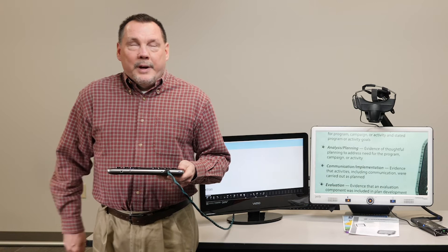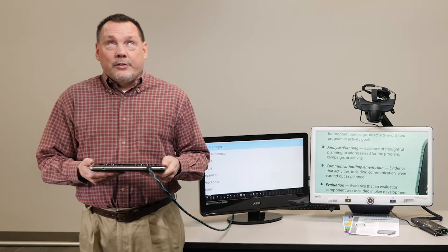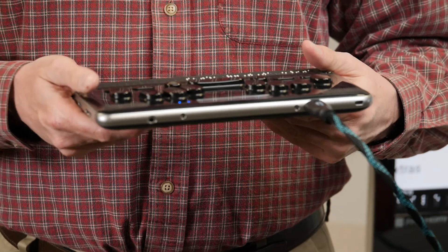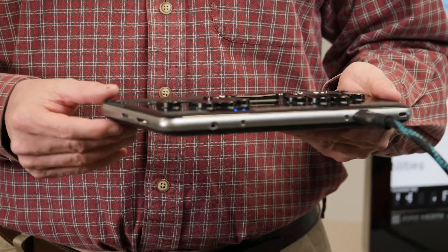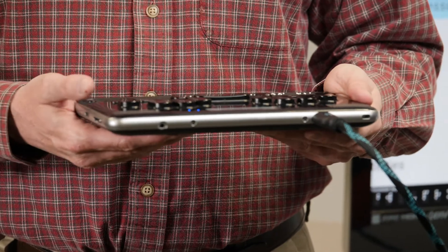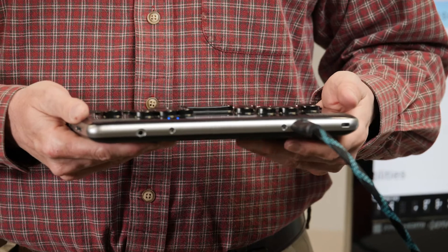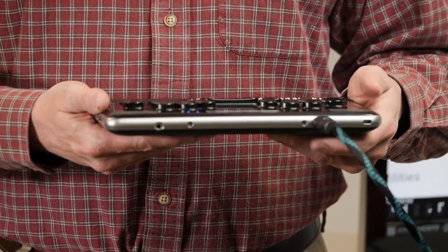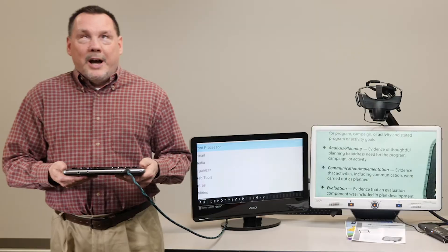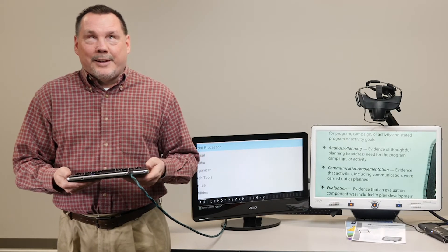It is an upgradeable platform, so as Android continues to advance, so does the device. I've got it here out of the case so you can actually see how thin it is — it weighs 1.6 pounds. There are too many features to get into in the short time we have here today. Right now we're running it from HDMI to a monitor. I apologize that a couple of the letters got cut off — we had a little bit of technical difficulty.